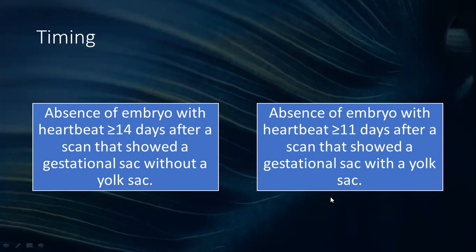Whilst we are looking at this matter of gestational sac diameter, remember our cutoff, which I was saying is 25 millimeters. I remember my lecturer, Barbara, once presented on this platform. She was giving us a testimony of one patient, who was actually a relative. When she scanned, she saw this empty gestational sac, no embryo. She scheduled a follow-up, scanned again, and still there was nothing. And this gestational sac, I think she said, had actually reached the 25 millimeters cutoff.